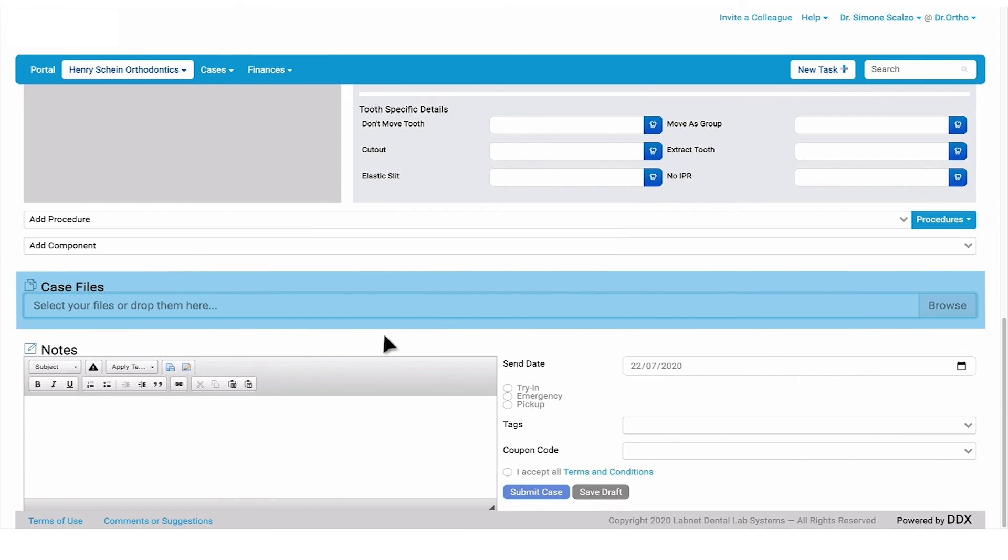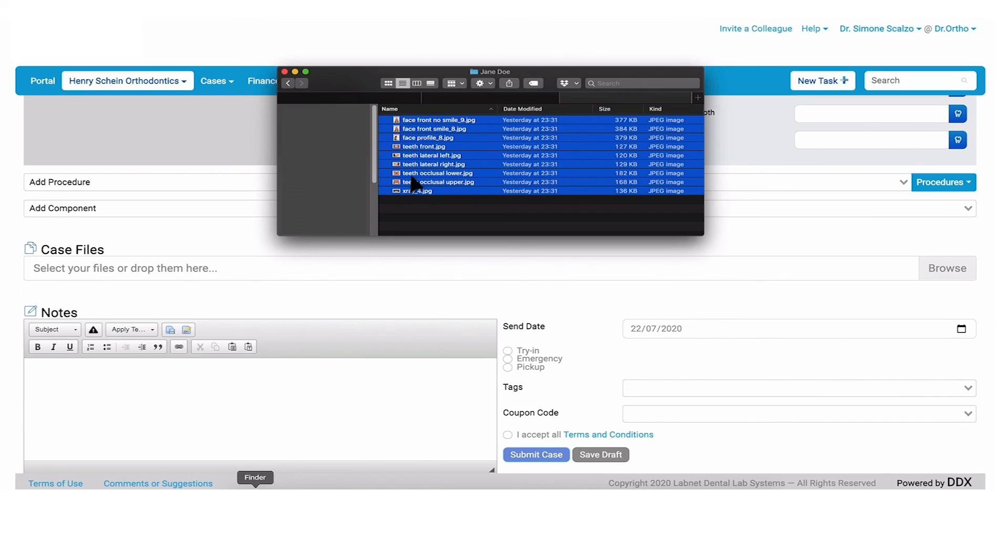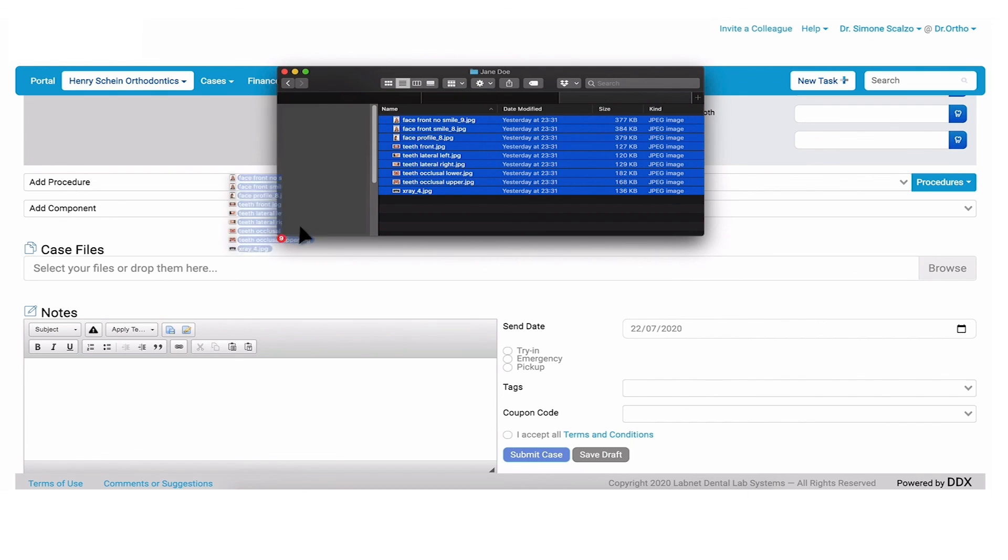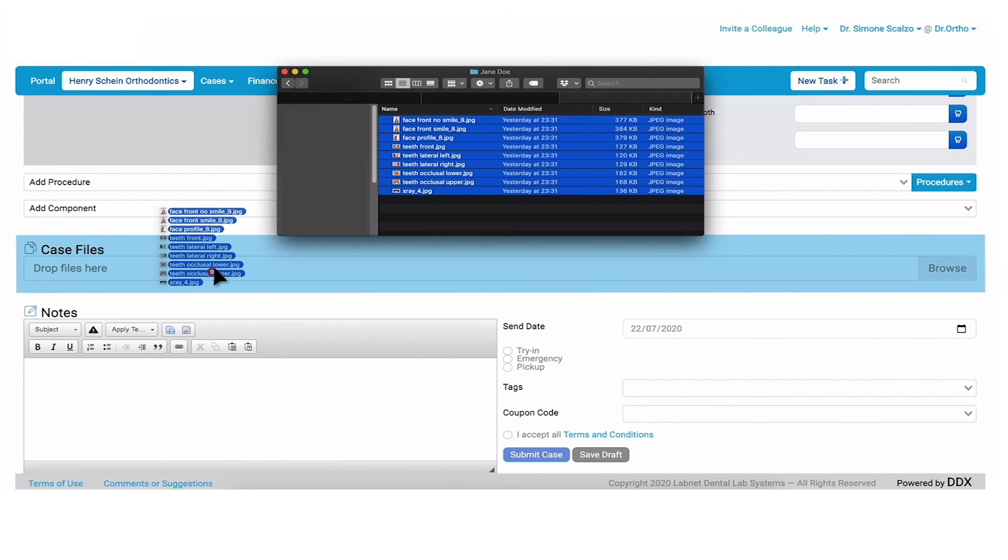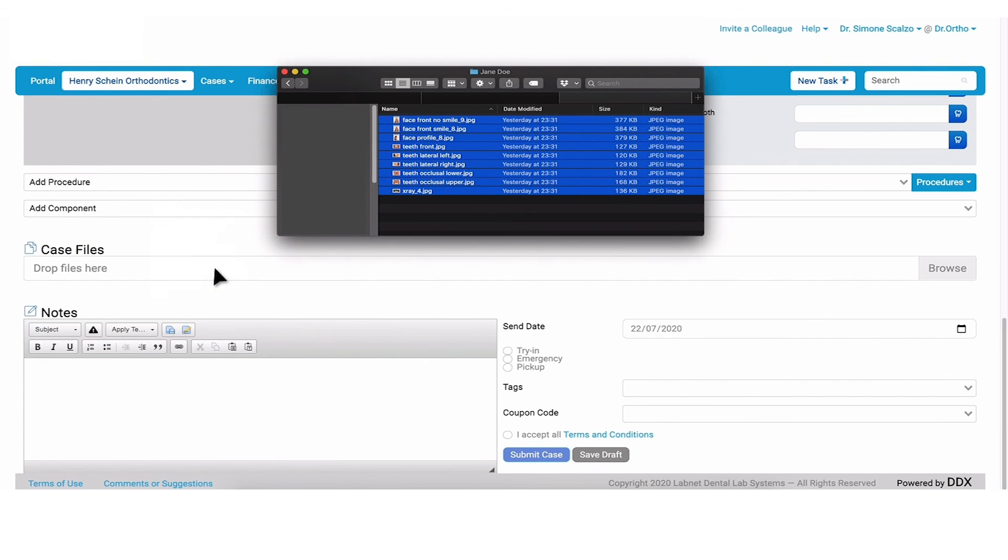On DDX, you can selectively upload individual files or drag and drop your patient's records as a group. To select all files, press Ctrl A or Shift and select All. Then drag the patient records into any area of the patient's case in DDX.